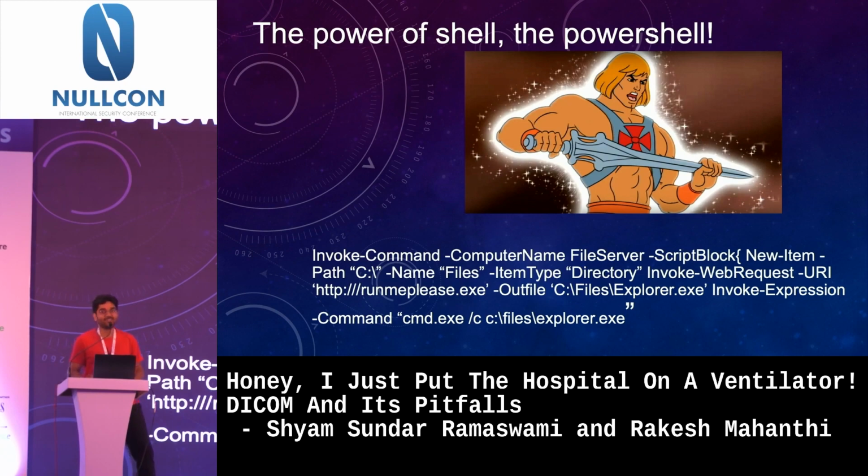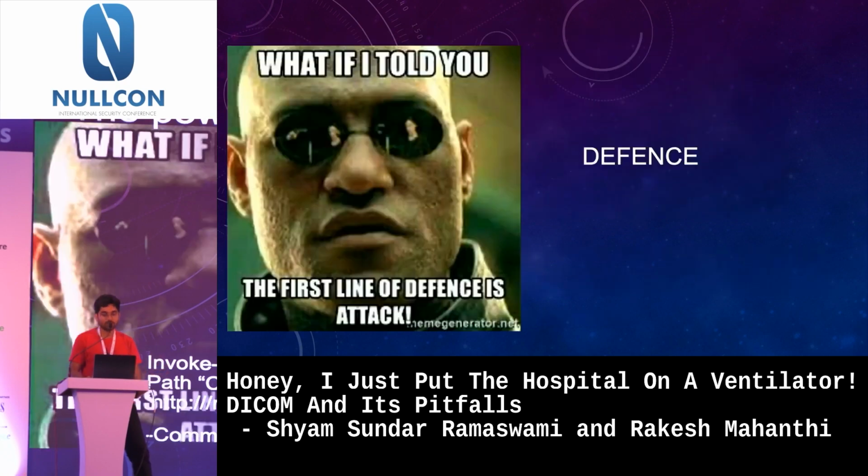So, the sword is actually unlimited power, and especially if you use PowerShell, it's a Windows utility to administer computers remotely. You can also embed a PowerShell script inside this DICOM and execute it, and it runs without being logged. So, let's get to the defense, the last set of slides.